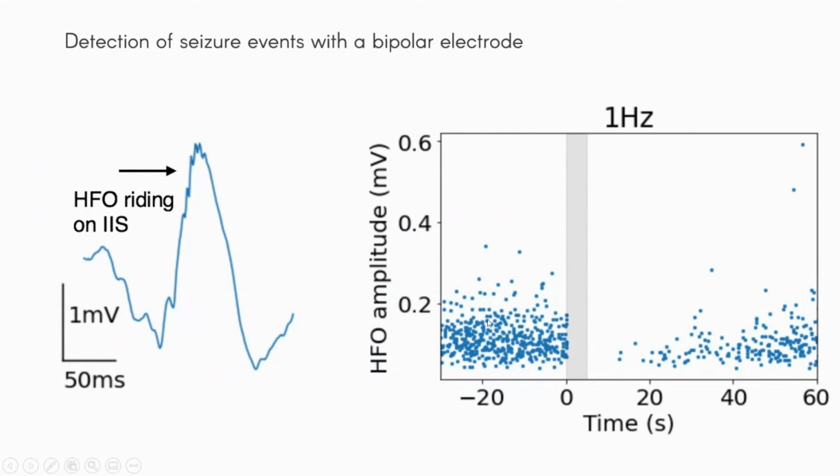And looking over time, I can deliver, let's say, a 1 hertz stimulation with ultrasound for 5 seconds. And here you can see basically a bunch of epileptic events stacked up over many, many trials, and whether they occur before or after the event. And you can see that the ultrasound basically shuts them down hard. The caveat here that I'm thinking about very often is whether or not this startle or this sound that they may be hearing stops seizures. And I'll tell you up front that it definitely slows them down. And most of my findings have to be a comparison of, does ultrasound do things beyond an animal hearing a sound?